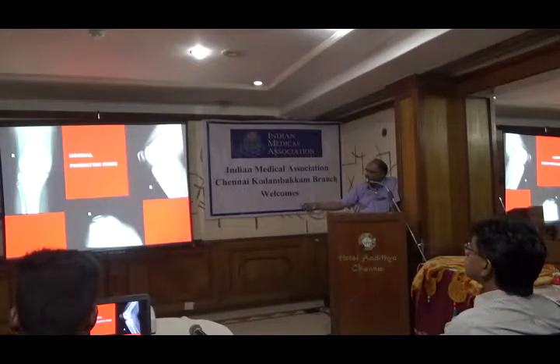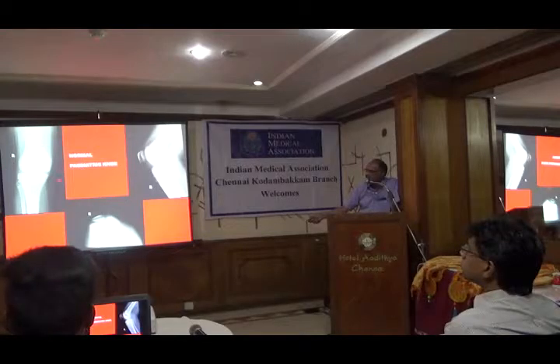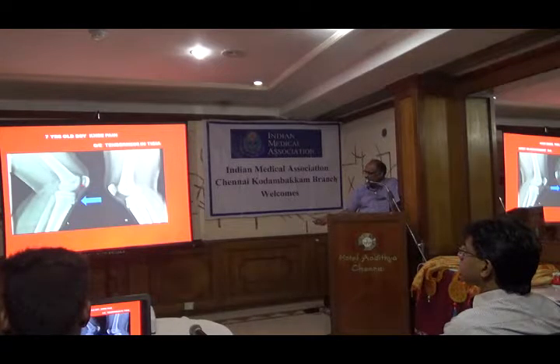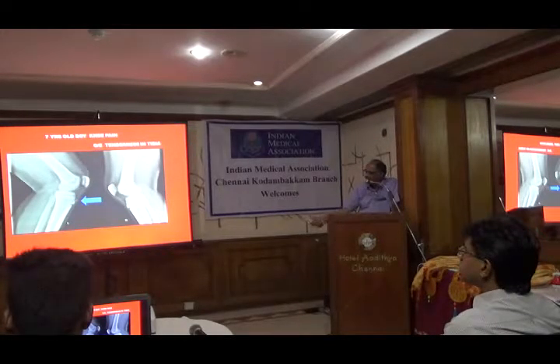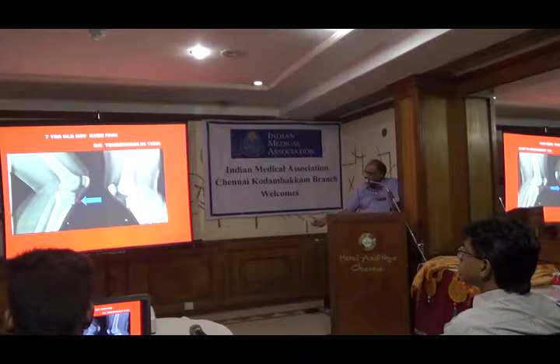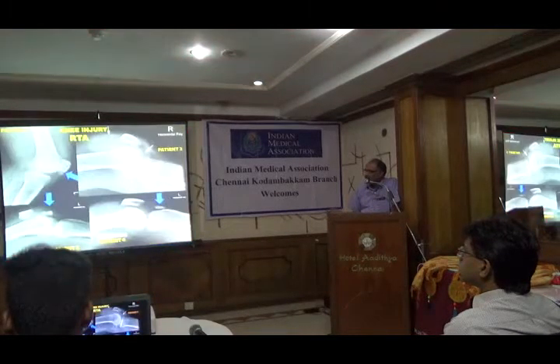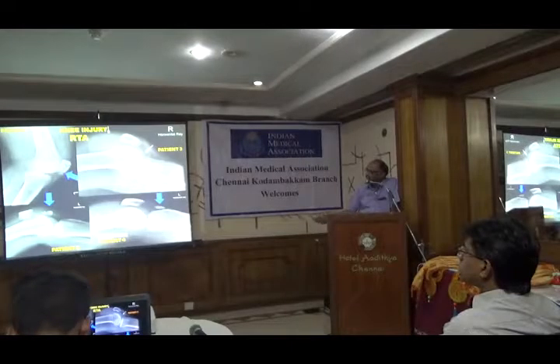Coming to pediatric X-rays — this is the epiphyseal line which has not fused. Don't mistake it for a fracture; up to 14–15 years this will be seen in all X-rays. Here is a 7-year-old boy with tenderness in the tibial tubercle area. When you take an X-ray, compared to the normal side where the tibial tubercle has not yet fused, here you see the patellar tendon involvement — that is osteochondritis of the tibia, also known as Osgood-Schlatter disease.